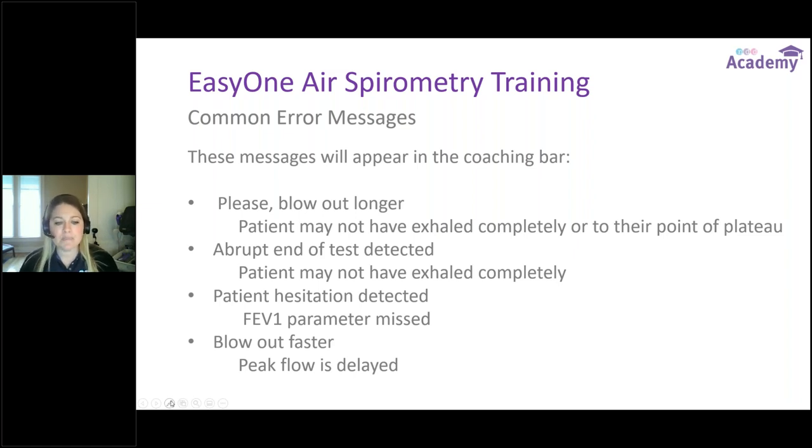The last common error is Blow Out Faster. There's a measurement at the very top of the exhalation where the patient punches it out hard and fast — that is the peak flow. If the patient takes their big deep breath in and then breathes casually instead of blasting it out — like blowing out birthday candles leisurely — we're going to miss that peak flow measurement. So encourage them: big breath in, then blast the air out as hard and as fast as they can.